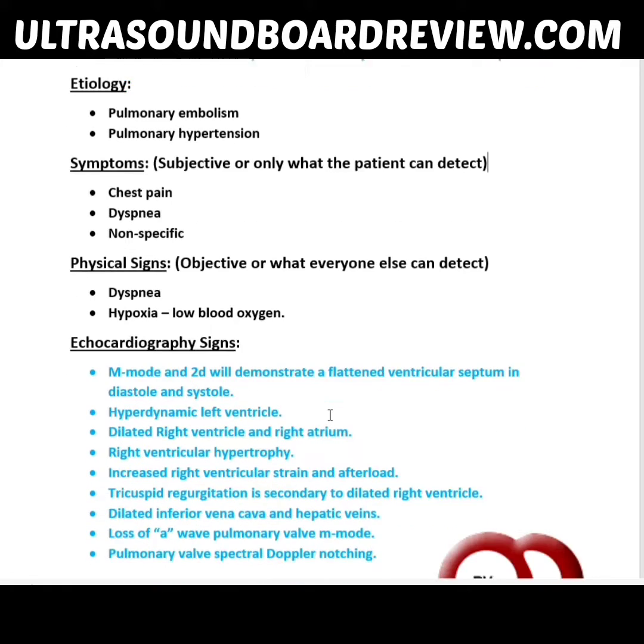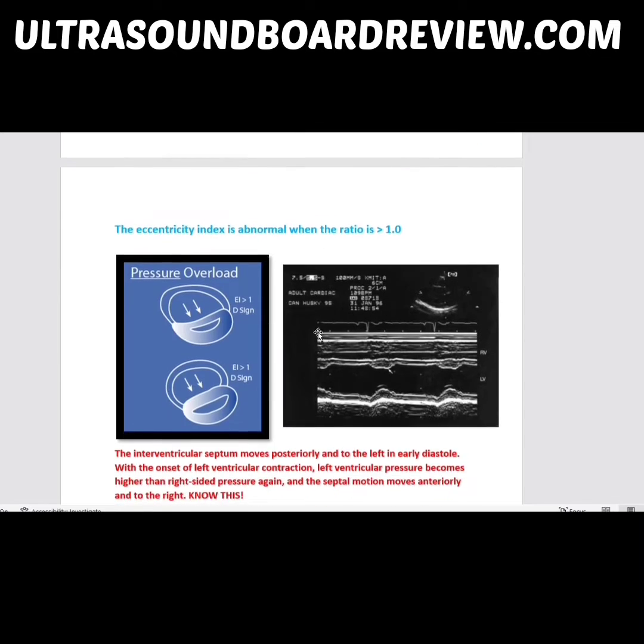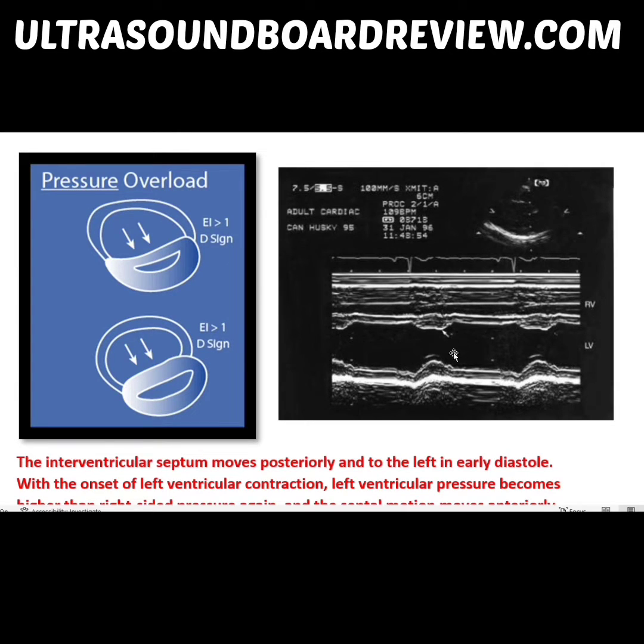So on echo, you're going to have M mode that will have a flattened septum in not only diastole but also systole. So on this M mode here, you can see that the septum is not only flattened in diastole here, but it's also flattened in systole.